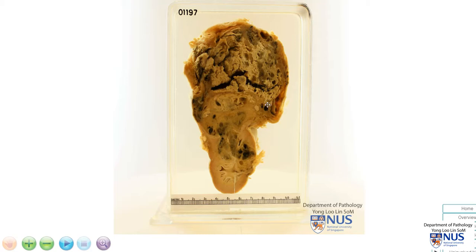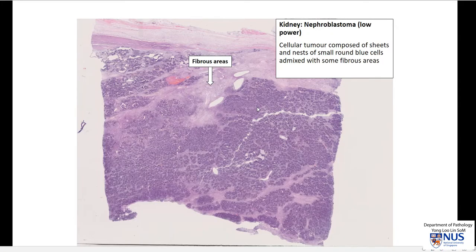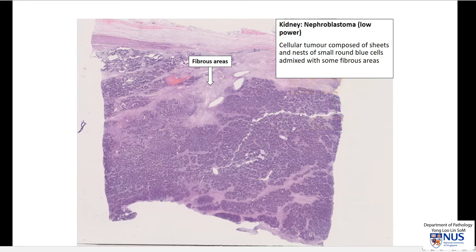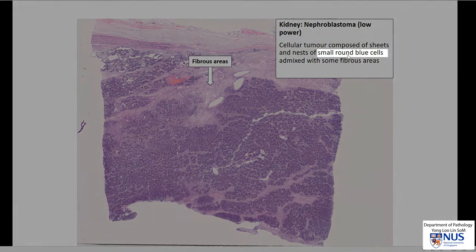Microscopically, they look quite interesting because they can have a triphasic appearance. These are actually immature tumors that try to recapitulate the developing nephron. Here is an example at low power — we can see a very blue appearance, and this is because it is composed of cells with very high nuclear-to-cytoplasmic ratios. This is a classical example of a small round blue cell tumor, and these are often the immature tumors seen in children.